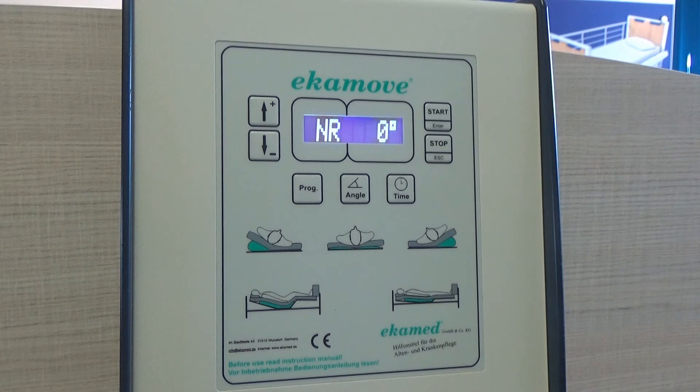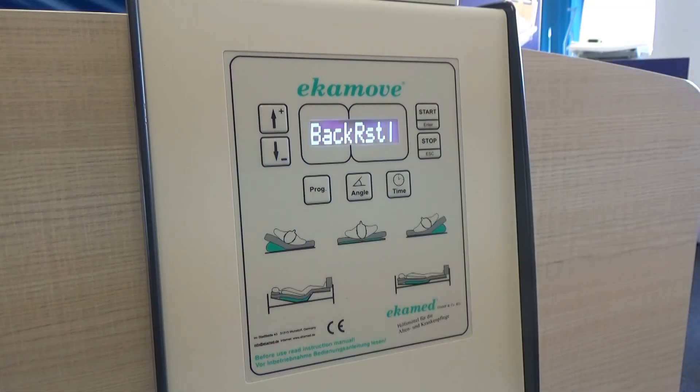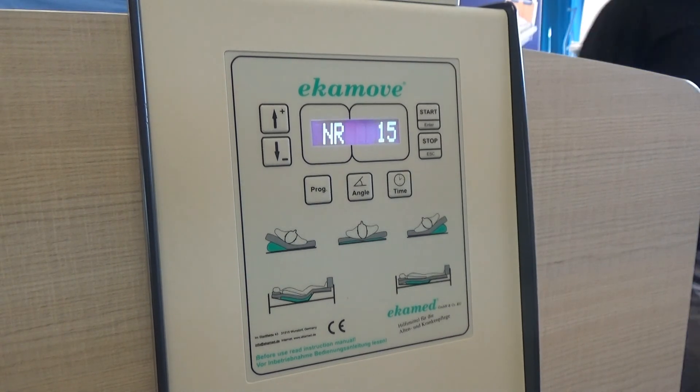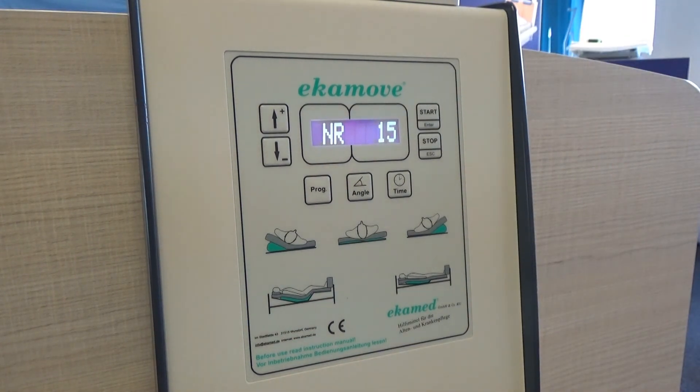At any point, you can press the time or angle buttons to check the status of the patient. For the safety of the patient, there are a number of error codes to alert you that action is required. The most common is the EXPOS error, which is when the backrest on the bed has been raised too high. On this model, you can see the word 'backrest' on the screen — just lower the backrest on the bed and this will disappear from the screen and the system will restart automatically.